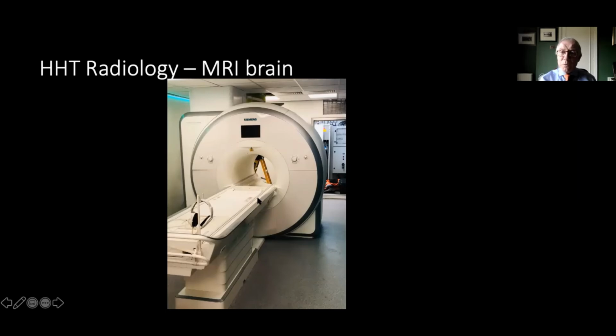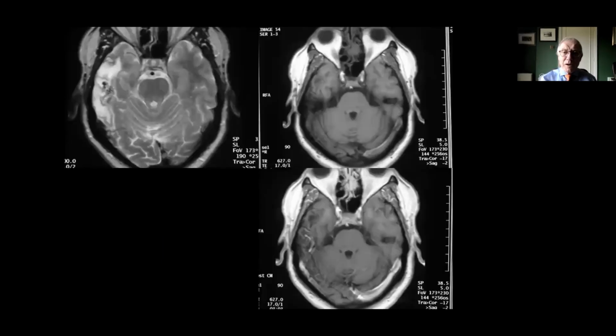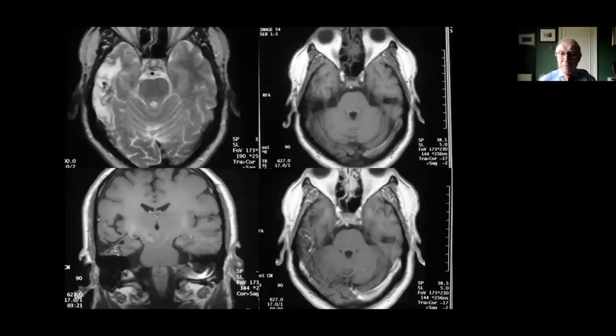We'll also give you a small injection through the IV line that you had put in on the morning of your visit for the echo bubble. So the same IV line is used and then we take it out afterwards. And what we're looking for on the MRI is a cerebral AVM or CAVM, an AVM in the brain. And these are just some MR images. The black dots that you see here and here, which show up white after we give contrast, represent a small cerebral AVM in this patient.